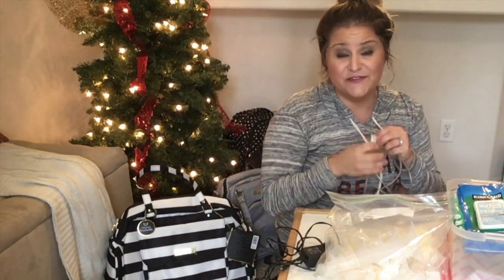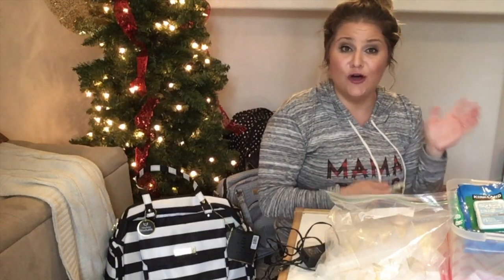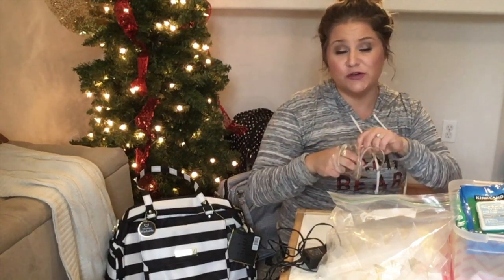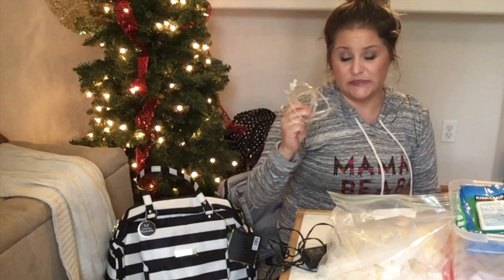I bought an extra set of tubes, so I kept a set of tubes at home and one at work. The tubes shouldn't be getting milk in them, so you shouldn't need to sterilize your tubes. If you do accidentally get milk in your tubes, just buy a new set. They're going to get ruined. You can call your manufacturer or look for an off-brand on Amazon.